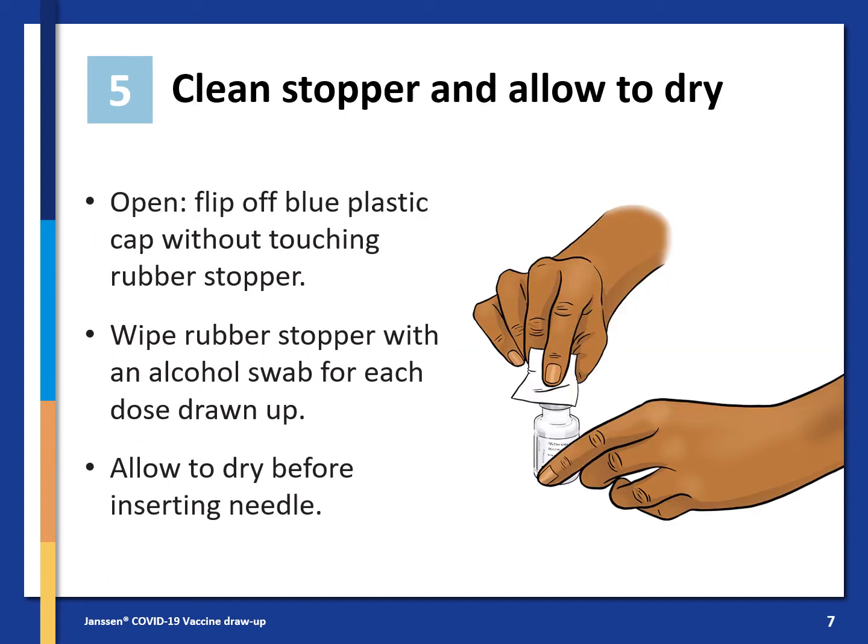Once mixed, you need to clean the stopper of the vial and allow it to dry. Do this by flipping off the blue plastic cap without touching the rubber stopper to open it. Wipe the rubber stopper with an alcohol swab before each dose drawn up, and allow the stopper to dry before inserting the needle.